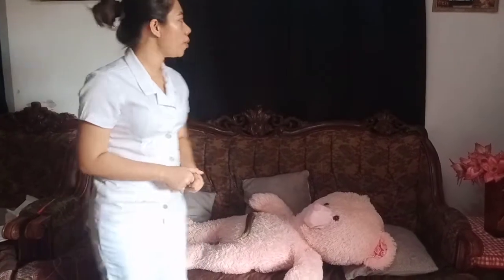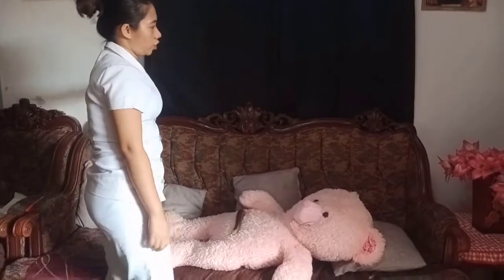Now we're going to provide the client's privacy to ensure the cooperation of the client. So ma'am, I'm going to close the door. Ma'am, is it okay to you? Okay, thank you. Then prepare the client. Prior to performing the procedure, introduce yourself and verify the client's identity using agency protocol.